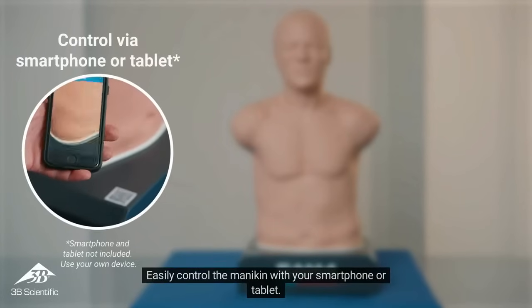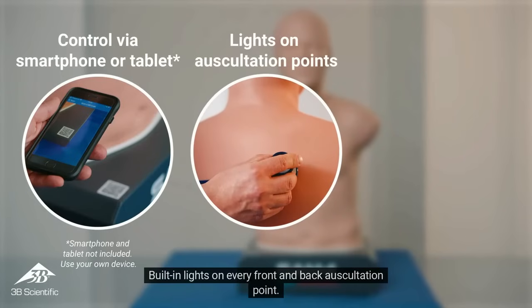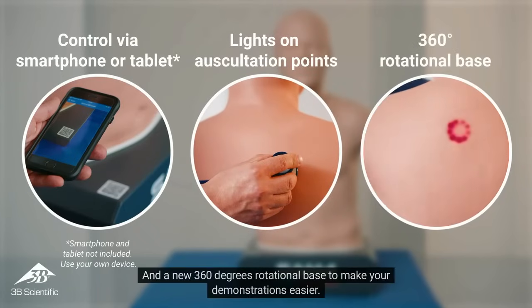Easily control the mannequin with your smartphone or tablet. Built-in lights on every front and back auscultation point. And a new 360-degree rotational base to make your demonstrations easier.